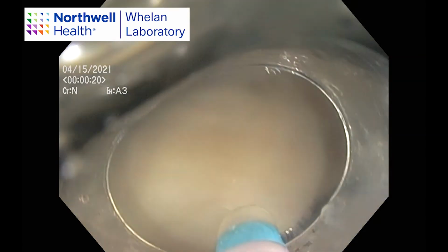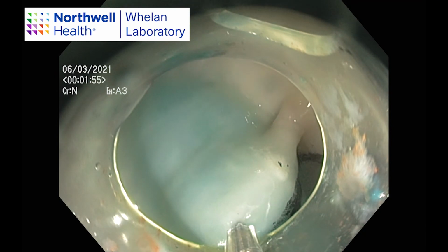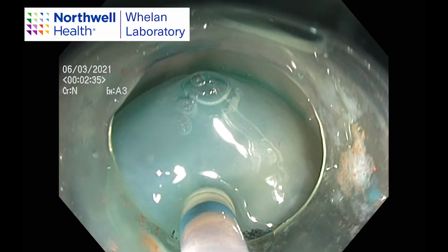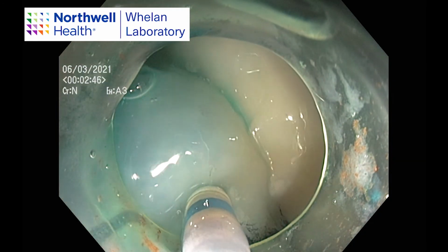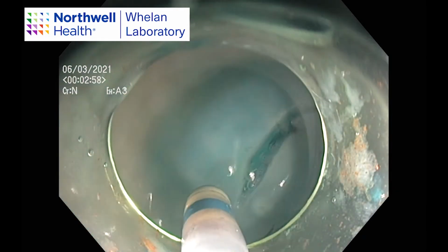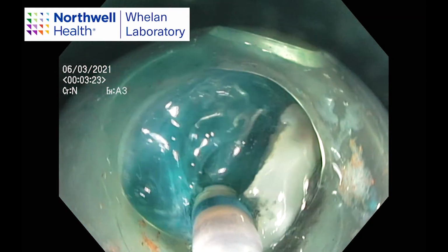The resection line was first marked with superficial spot burns. Next, the lift injection is made. It is critical that a superficial lift be made by injecting the submucosal layer. A proper lift is round and tall, and the dye color is clearly seen. Next, the mucosa is scored with the needle knife for 10 to 20% of the circumference. The cut edge is next undermined with the needle knife to create a ledge.